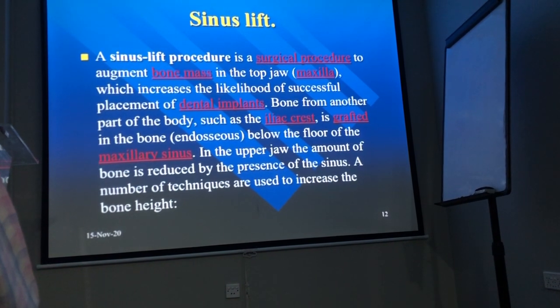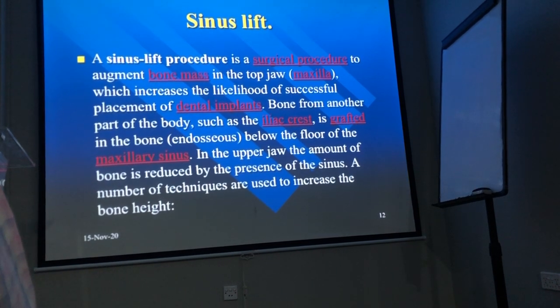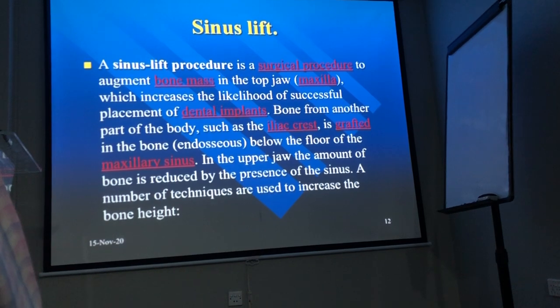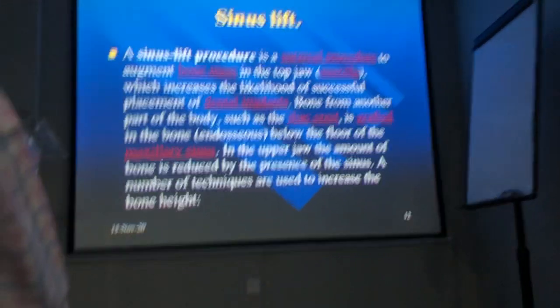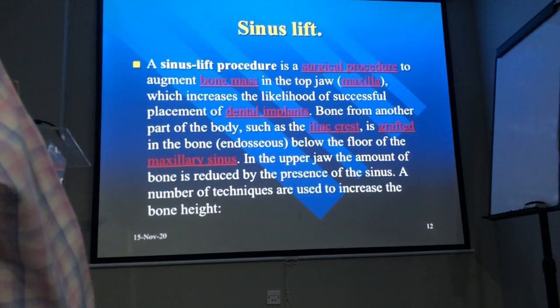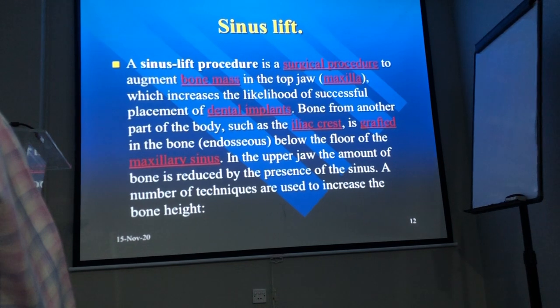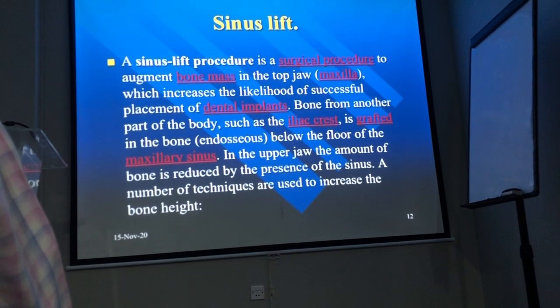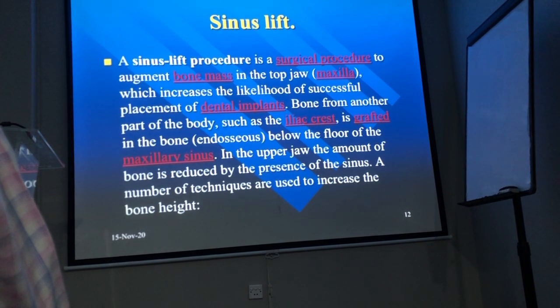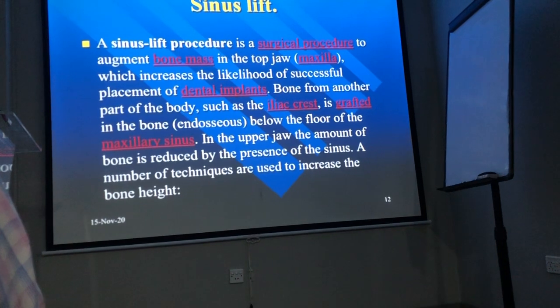Now, what essentially is a sinus lift procedure? It is basically a surgical procedure that allows us to augment bone in the maxilla, which increases the likelihood of successful placement of dental implants. Now, most of the studies available in the world are on failed or failing implants. Why?